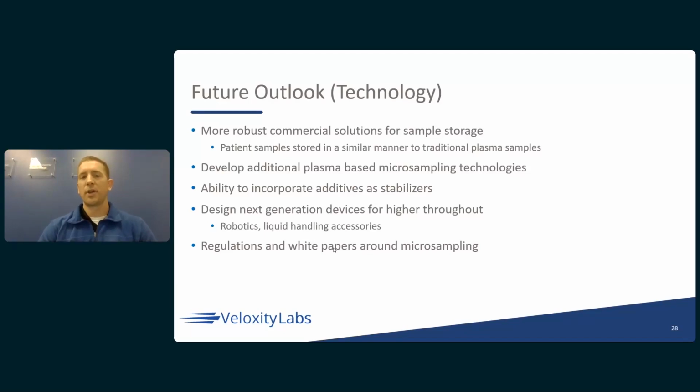So the decentralized clinical trial space is continuing to grow. We're going to see this implemented. The technology is only going to improve. From our end, the sampling side has progressed quicker than what we typically have to support us on the laboratory side. So we would like to see some more robust solutions for just sample storage. Some of those demonstrations that I showed earlier, those racks that we hold the TASO devices in, we actually had those custom 3D printed because there is not a really good commercial solution.